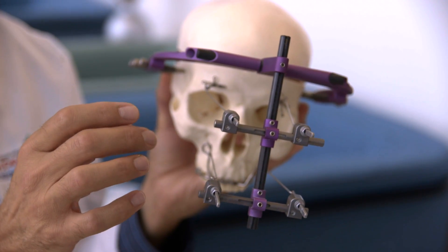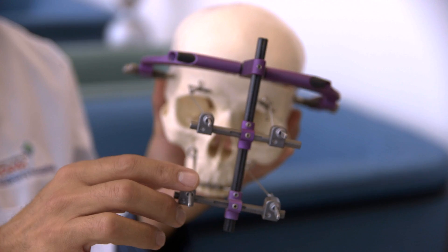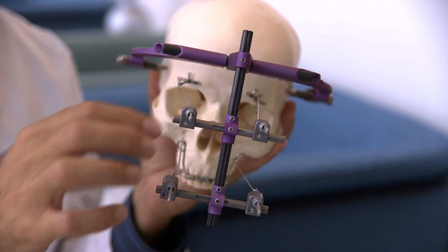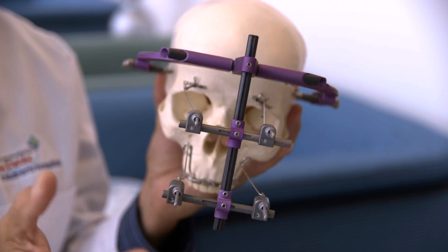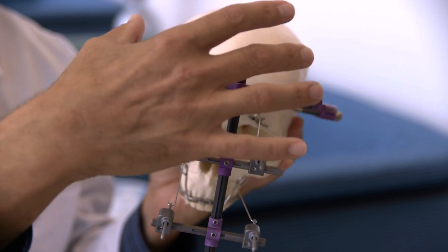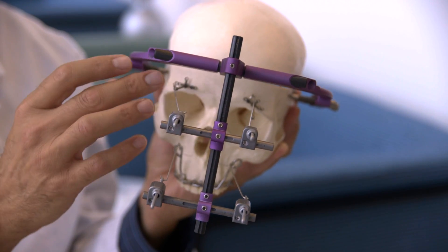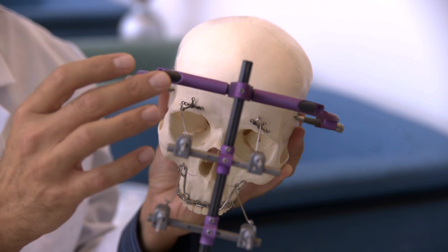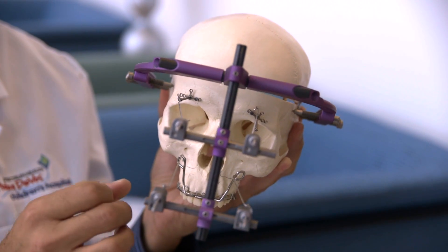The appliance allows us to move the facial bones in any direction we want — there's a lot of versatility in this system. We can move these bars up and down, turn them from side to side, rotate them, or expand and open them. Depending on the patient's requirements, we can move the face forward, downward, a little to the left, or a little to the right — whatever the patient needs in their treatment.